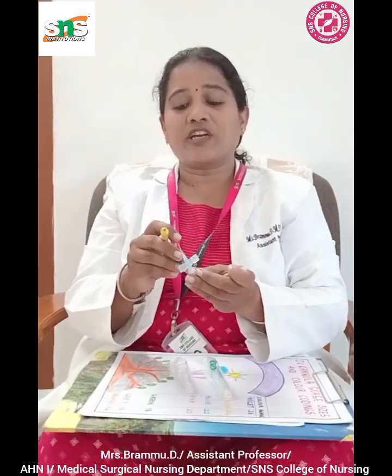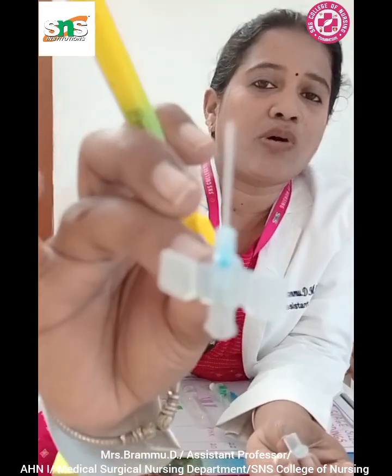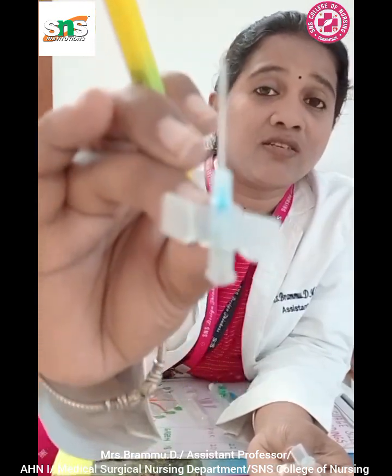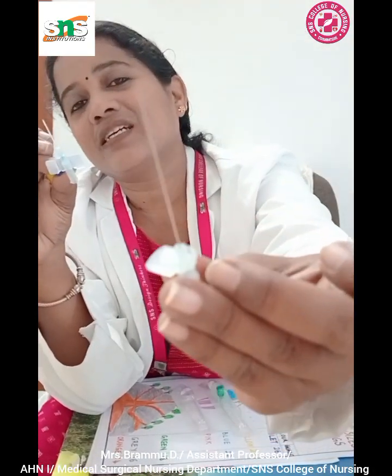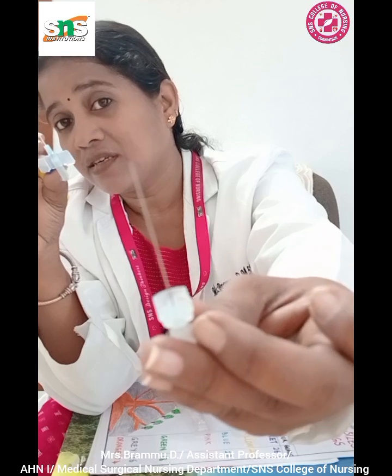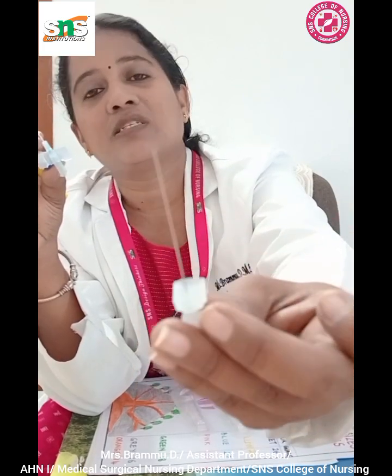And finally comes your catheter and the needle. So I would like to explain about the catheter. This is the only part going into the patient's IV line, and the catheter is what stays in situ in the IV line, not the needle. The needle acts as a guide wire, or you can call it a guide. Once we are confident that the patient's vein has no phlebitis and there is no chance of counterpuncture, then you can directly place the catheter.